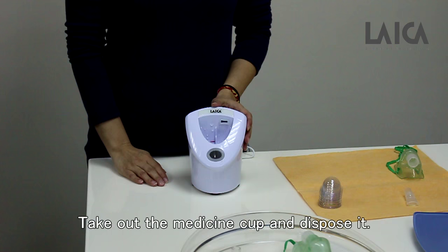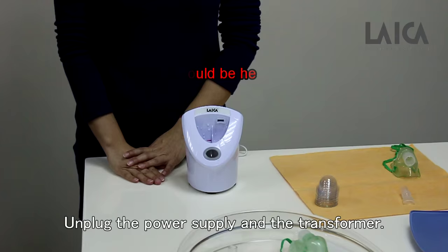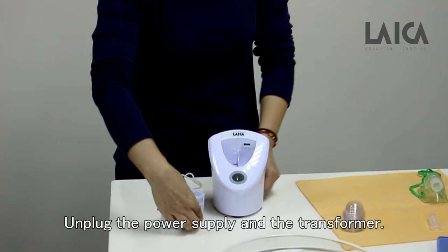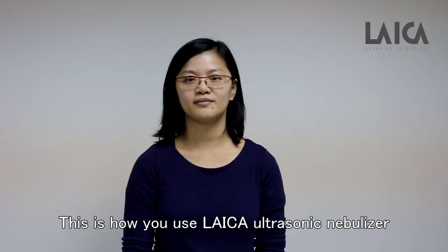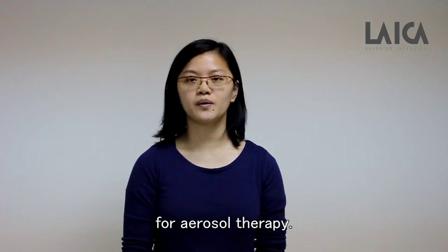Let the nebulizer cool down for some minutes before cleaning it. Unplug the power supply and the transformer. This is how you use LAICA ultrasonic nebulizer for aerosol therapy. Thank you.